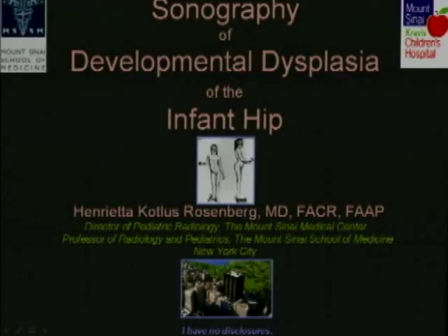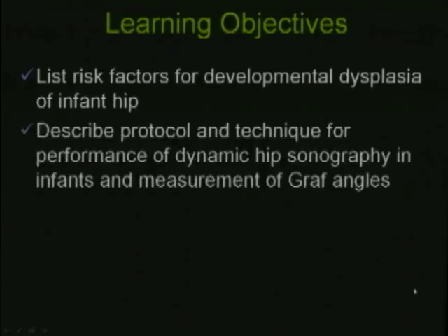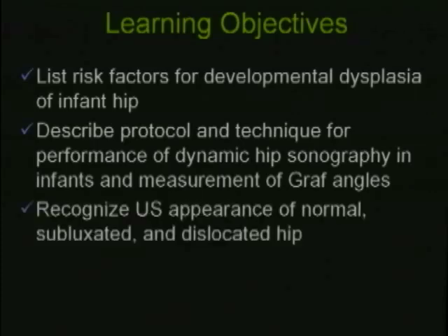Sonography has revolutionized the evaluation of developmental dysplasia of the infant hip. The learning objectives for this presentation are that when I'm done, you should be able to list the risk factors for developmental dysplasia of the infant hip, describe the protocol and technique for performance of dynamic hip sonography in infants, and how to measure the Graf angles.